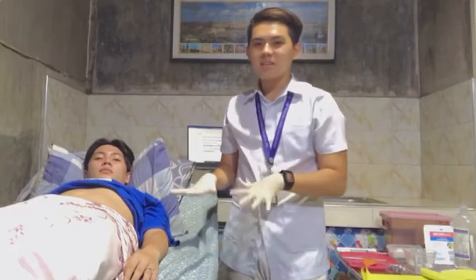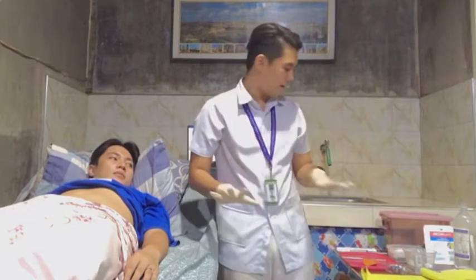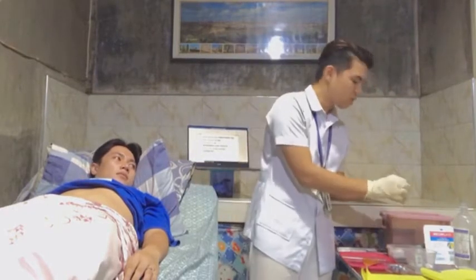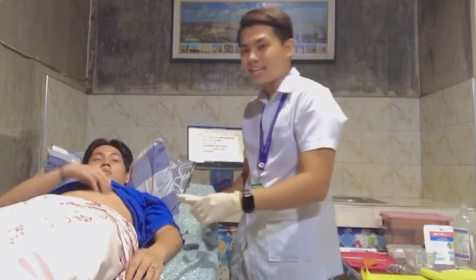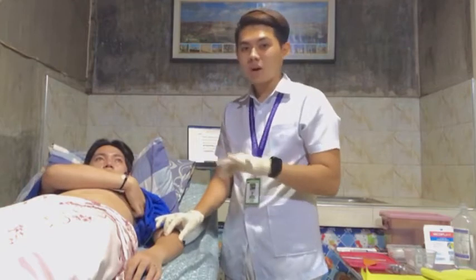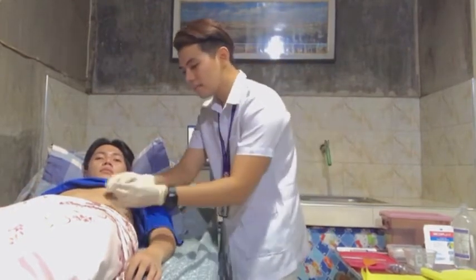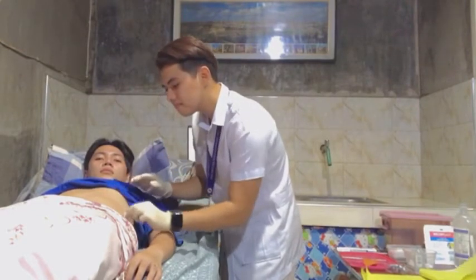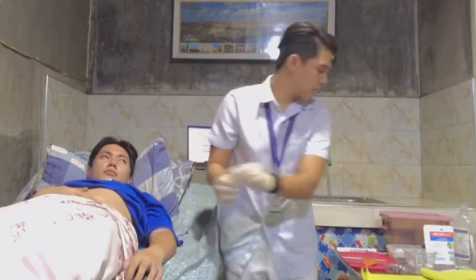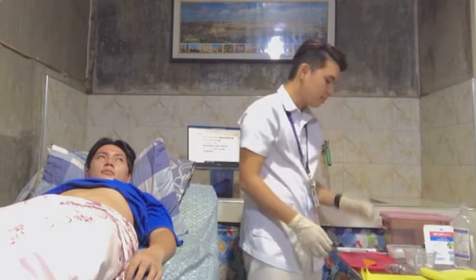We need to clean the site with an antiseptic swab in a circular motion, starting from the center outward. We must use the cotton ball because friction aids in cleaning the skin, and a clean area is contaminated when a soiled object is rubbed over its surface. So let's start here. Throw this one, and then next we will be needing this one.